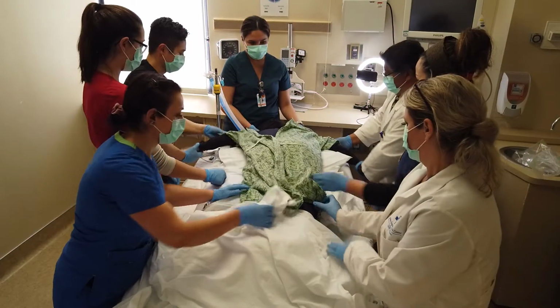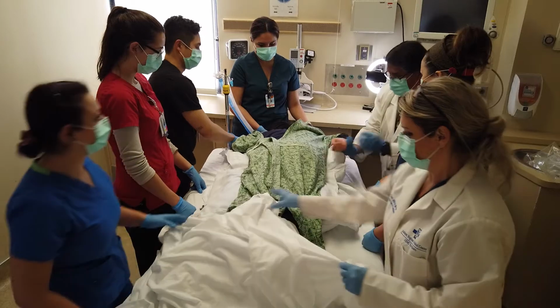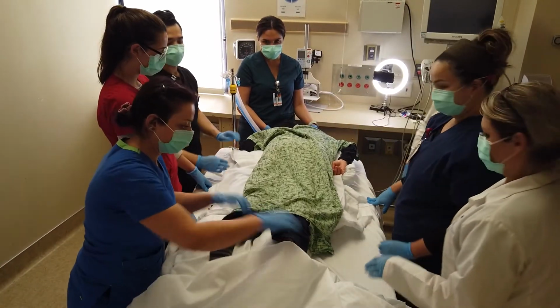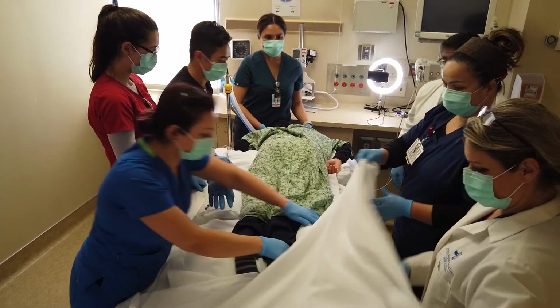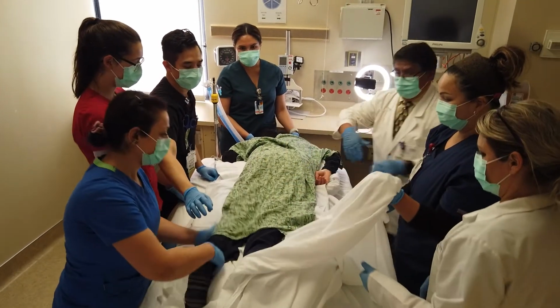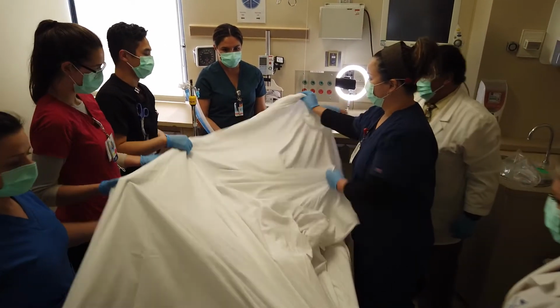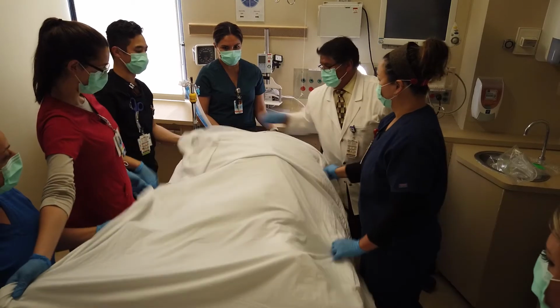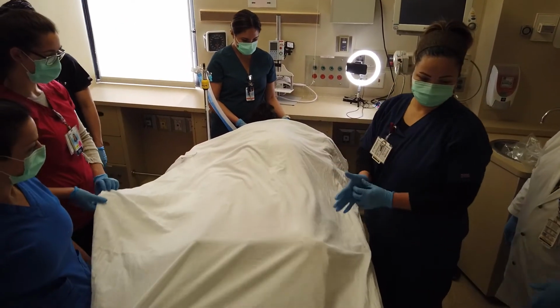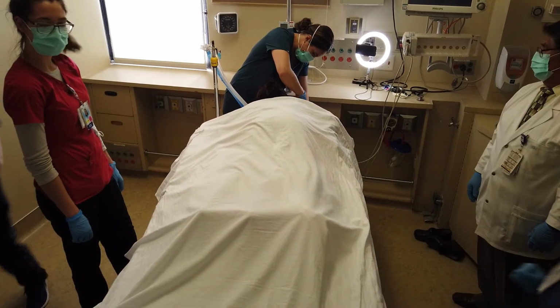Once the patient is prone, we can then reposition the patient with one arm up by the head, palm down, and one arm lateral to the body on a pillow. The RT will then again verify the ET tube placement, while another RN will verify all the line placement and securely fasten them prior to positioning the patient to the reverse Trendelenburg. We can also apply the EKG on the back of the patient, mirroring that of the anterior placement.